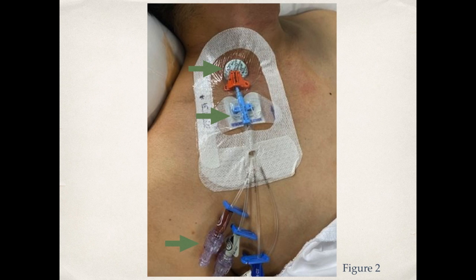So occlusion is one of the most common complications of CVADs. Around 25% of all patients who have a CVAD will experience an occlusion. So it's really important that we maintain our CVAD using the correct policy and procedures, and this can help maintain patency. So an occlusion is a partial or complete blockage of either one of the lumens on a CVAD when aspirating or injecting. So it can be defined as the inability to infuse or inject through a central venous catheter, inability to aspirate blood from a catheter, or both.